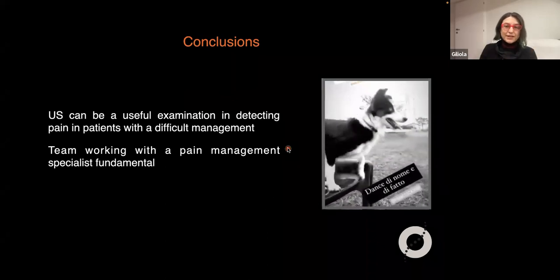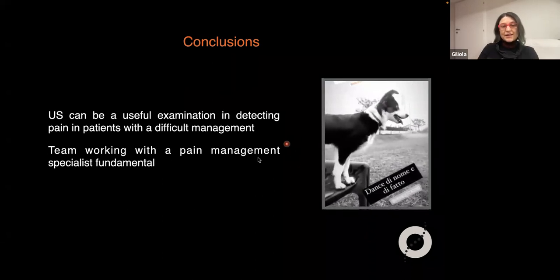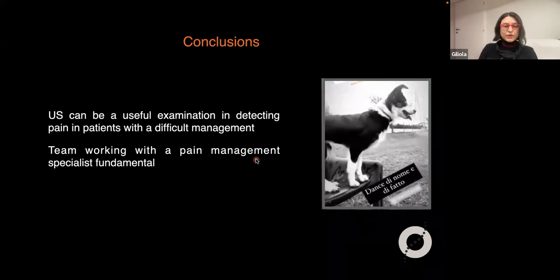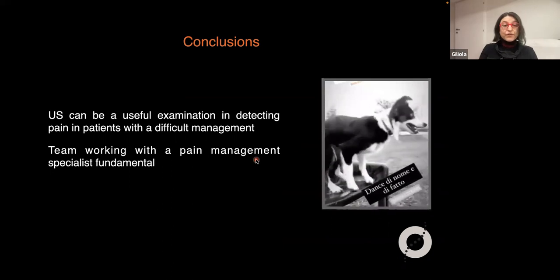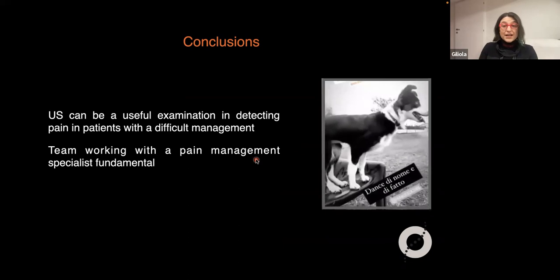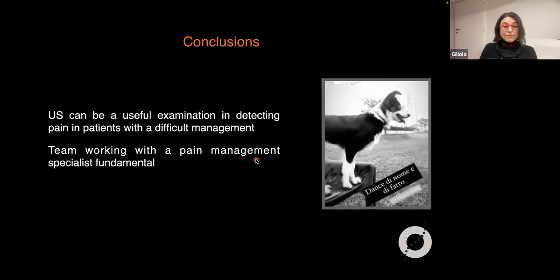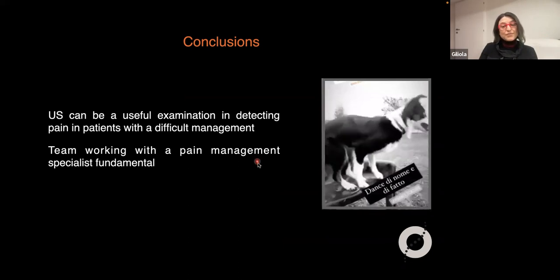But you need to find out which muscle and tendon is affected. And then even if you are not a superb ultrasonographer, if you learn to find scattering artifact, you can use that to inject locally the pain management and make the life of your patient so much better.